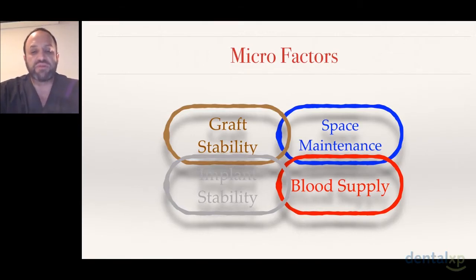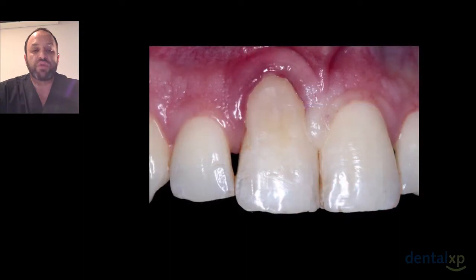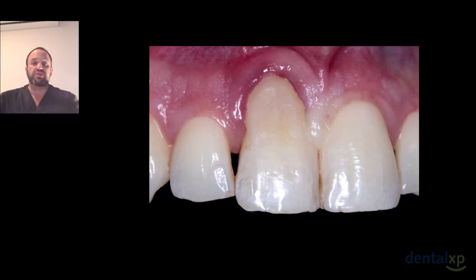Now, what I'd like to do is just share a short video with you, which shows a case where a patient of mine had external root resorption, and we'll look at the cone beam CT in a second. Instead of having the treatment done, he decided to go for a second opinion. The dentist decided it's not a problem, he can just cut away the gum and put a nice filling in there and fix everything up with a short filling.